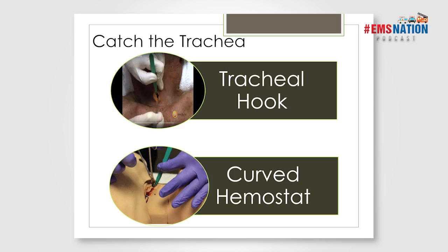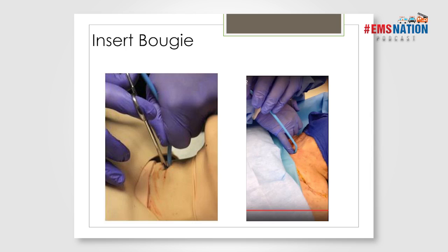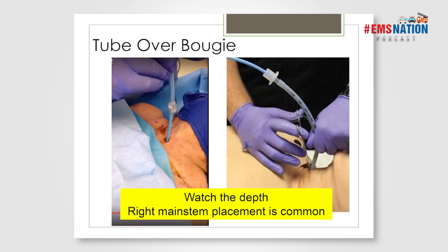With the curved hemostats in there or the tracheal hook in there, slide your bougie down in until it gets stuck at the carina. If it doesn't get stuck, you're either in a false passage or you've managed to perforate all the way through the trachea and into the esophagus. Just like when we use the bougie in regular intubation, you want to insert it until it gets stuck. Keep in mind, though, you've eliminated all of your dead air space above the cricothyroid membrane, so it will not appear to need to go in anywhere near as deep as you otherwise would expect it to. With the bougie in place, you can then take the hemostats or your tracheal hook out, and then you slide your endotracheal tube in over the top of your bougie.